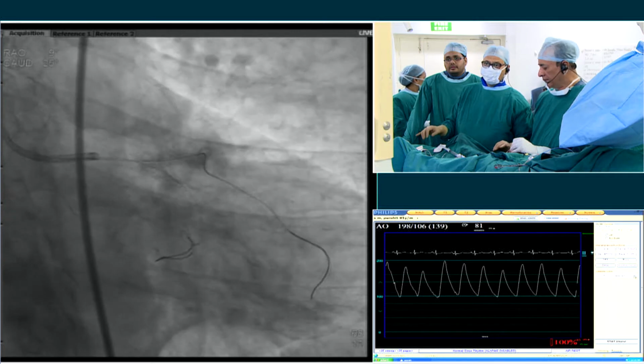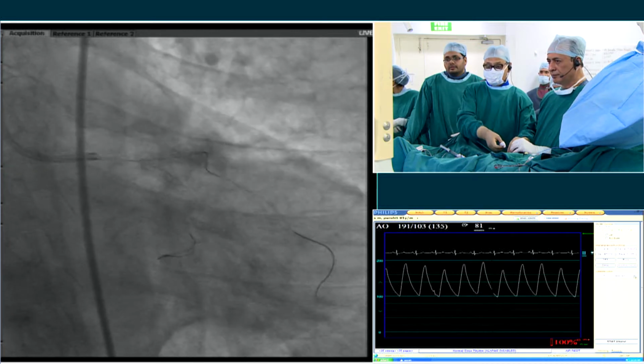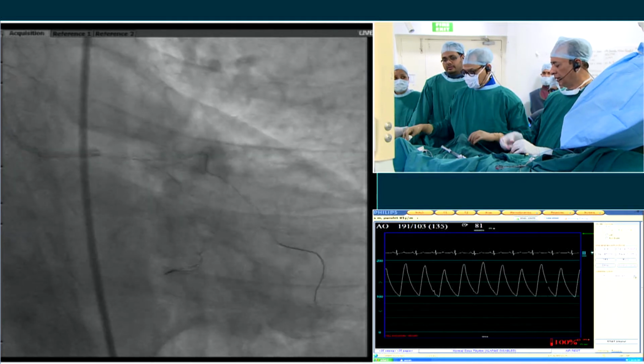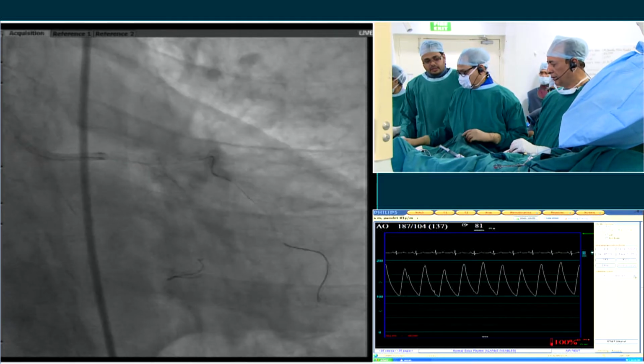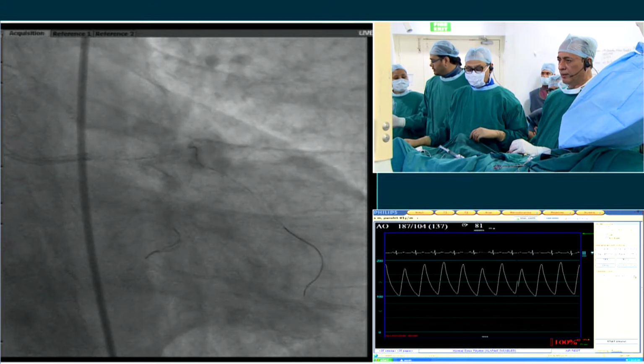Inject. But I can tell you that step would have been a lot more challenging had you not done that first ballooning and kiss. So that extra step was important. Balloon, I think I'll inject.